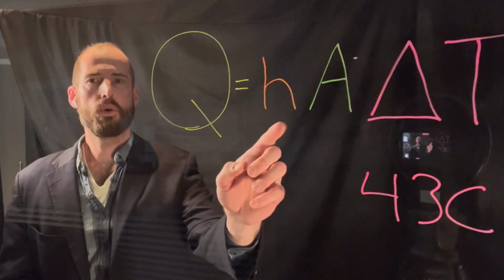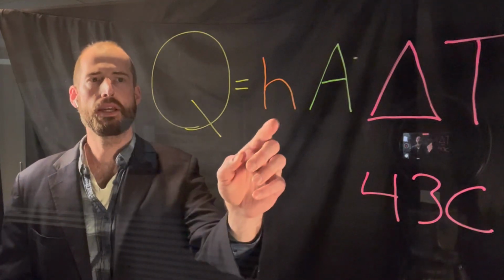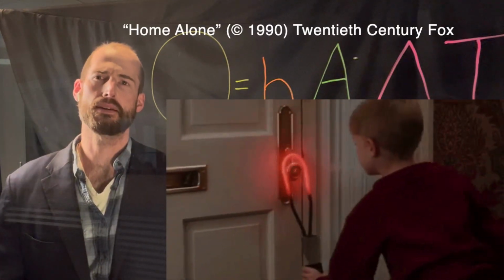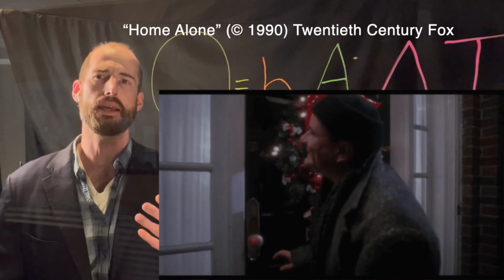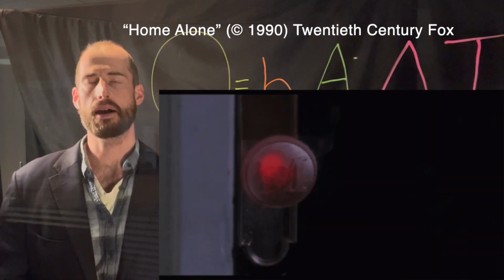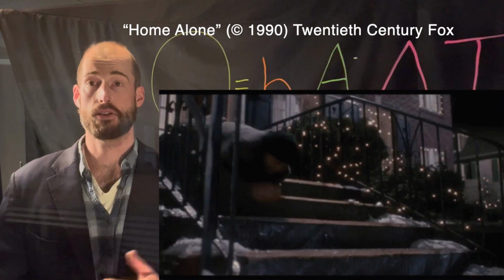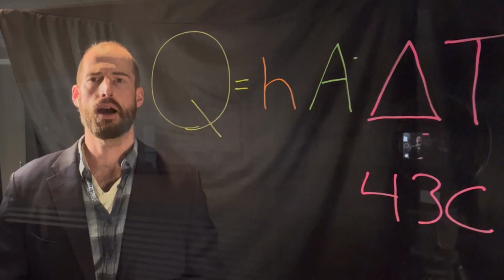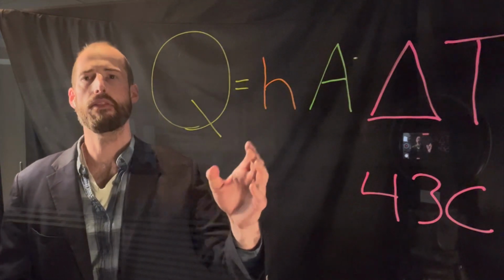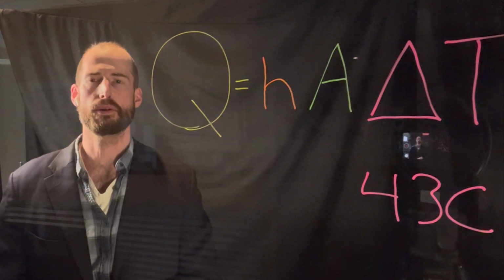So with safe and effective patient warming, you want your heat transfer coefficient not to be too high. And that's, again, when you think about that skillet in the oven theory. A metal plate would transfer heat so effectively that it could overwhelm the body's ability to safely remove that heat and potentially injure the patient. However, if you take the other extreme, if you had a heat transfer coefficient that was incredibly low, you wouldn't accomplish any meaningful patient warming.